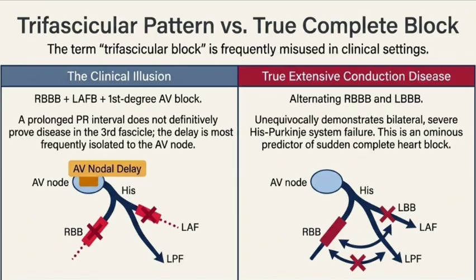So let's look at the specific detour caused by the left anterior fascicular block, the LAFB. Okay. Because the signal takes that massive U-turn toward the blocked front left area, it pulls the compass needle with it, causing what you call a left axis deviation. Exactly. Specifically, the vector shifts between -45 and -90 degrees on the wheel. And the QRS complex, that big spike, usually stays relatively narrow, under 120 milliseconds.